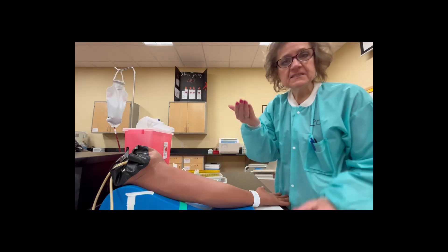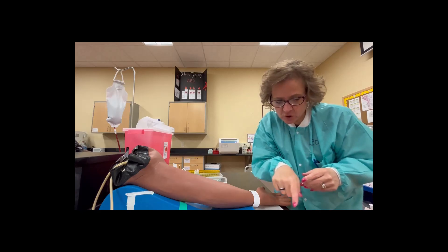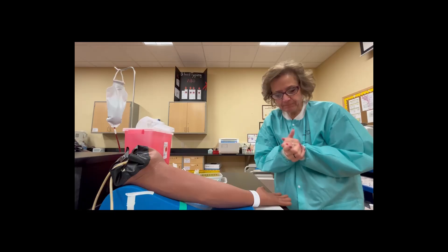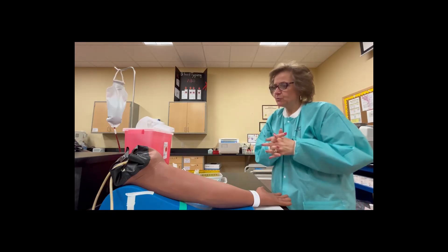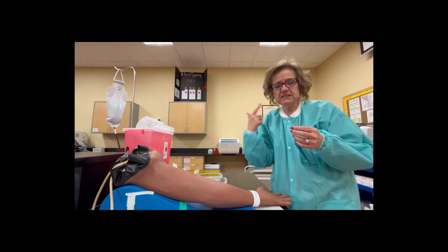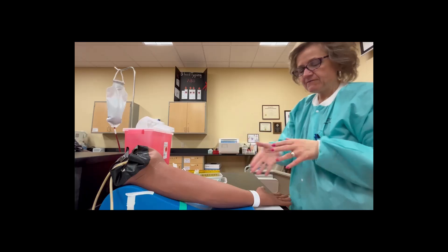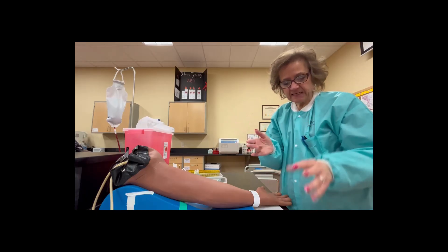While doing your hand sanitizer, ask: 'Could you please spell your last name for me?' — and I'm going to be looking at my label while that patient is spelling their last name. 'Great, and what's your date of birth? Great, that's what I have here too, thank you.' Make sure that you are looking at the orders when you are listening to the name. Once I've confirmed the correct patient, my hands are sanitized, so I can now put my gloves on.